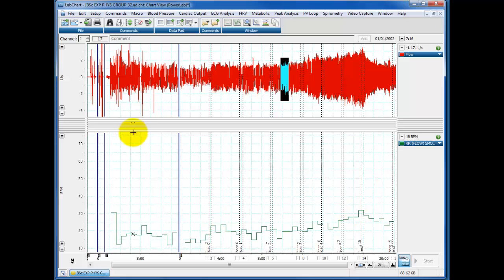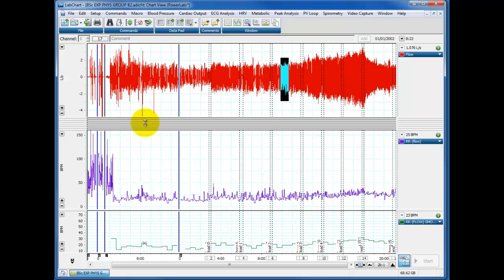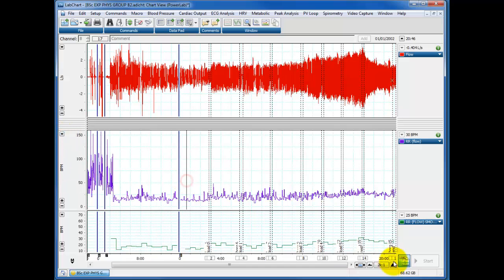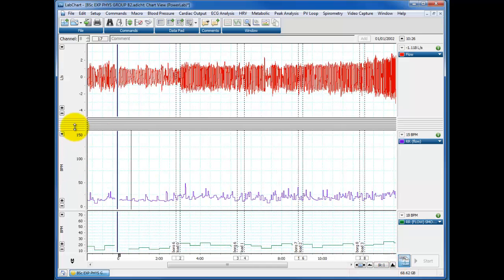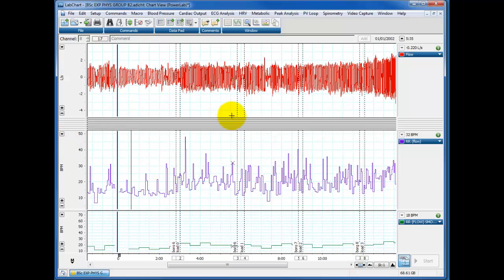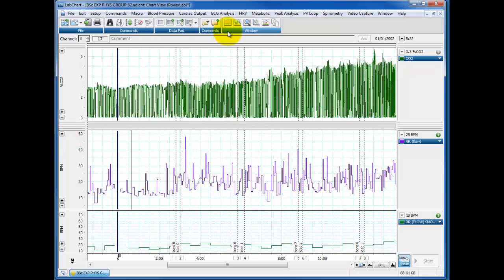Click OK again. And lo and behold, again, we have our respiratory rate. This time it's taken from the, let's zoom in a bit. This time it's taken from the end tidal CO2s, which is this channel here.